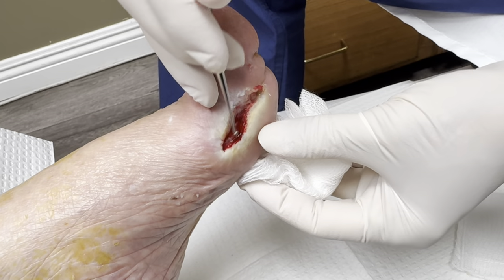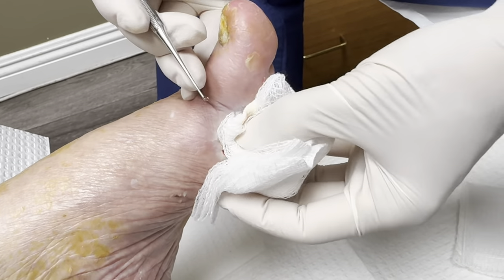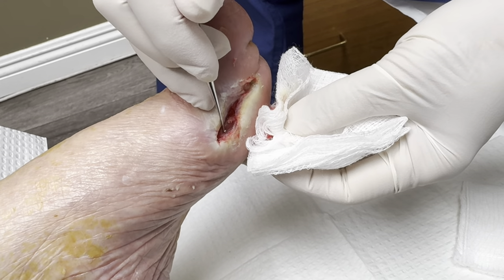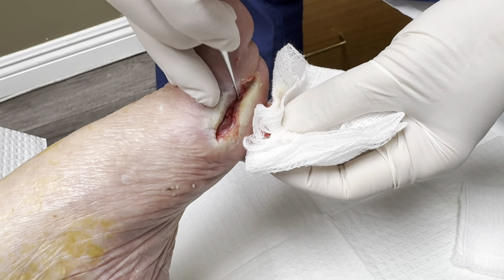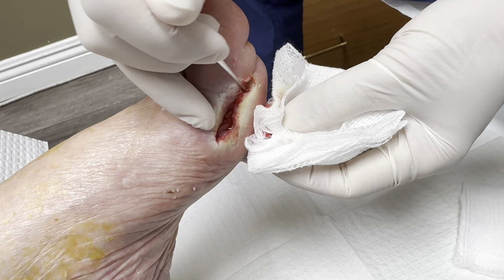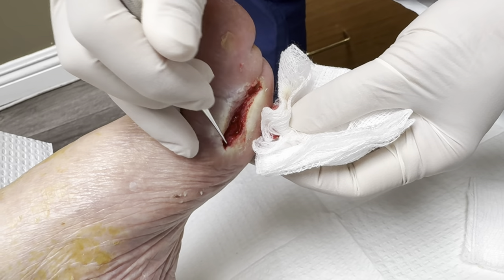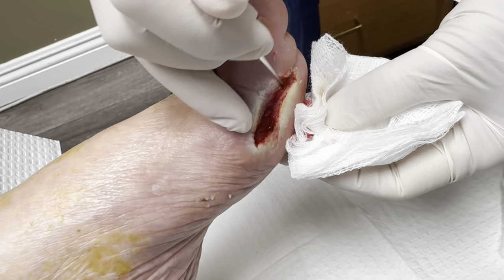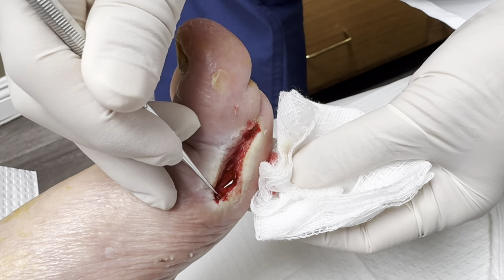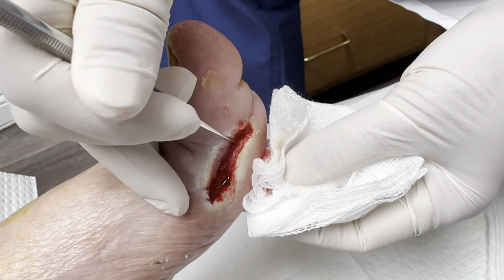So we need to clean the edges so that it bleeds well, and then we're going to put a graft there. This is an amniotic membrane graft — it's amazing stuff. We're going to start this today, this is our first treatment. It's going to close really quickly because it's amniotic — baby amniotic fluid, reconstituted and made into a graft. It's going to regenerate all the new tissues. Baby amniotic sac has a lot of growth factors.